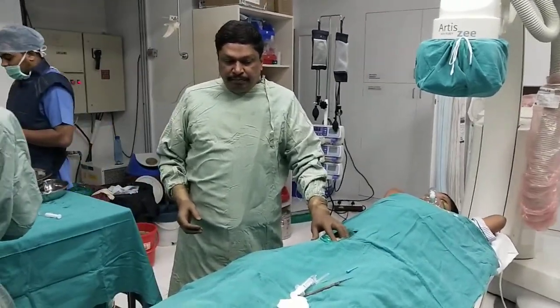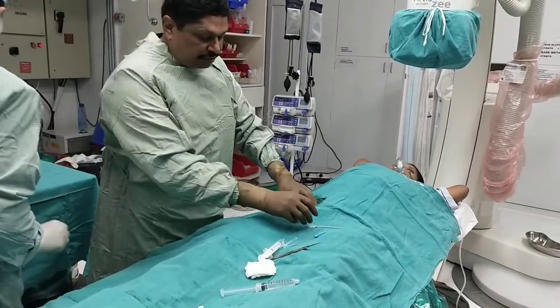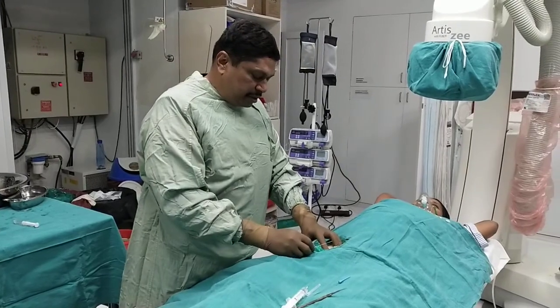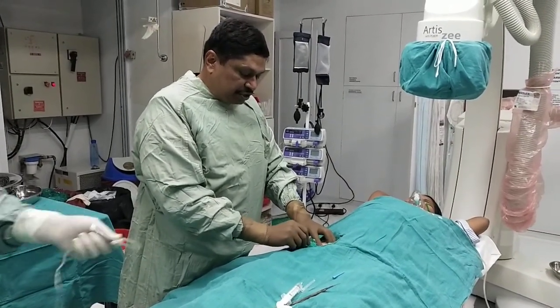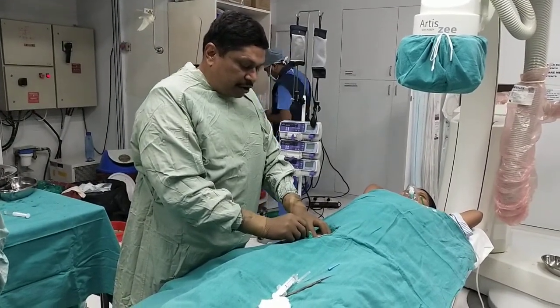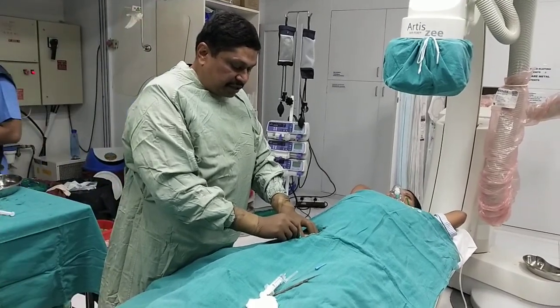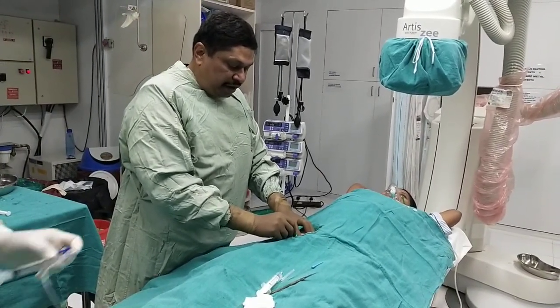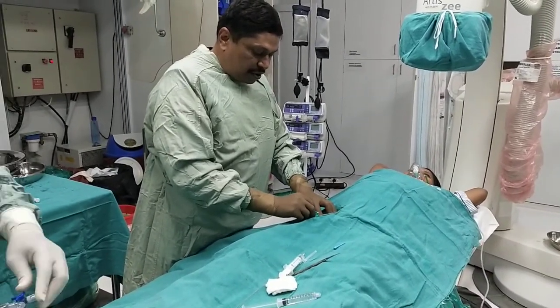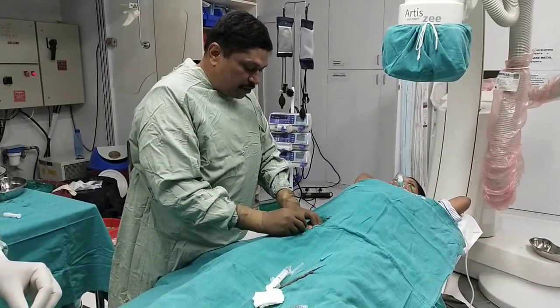Welcome. This is the patient — a 39-year-old female with moderately severe mitral stenosis, valve area of 1 cm², echo gradient of around 30 by 20 mean, and a Wilkins score of around 8 with moderate thickening and moderate subvalvular disease. We are performing a balloon mitral valvuloplasty in her case.